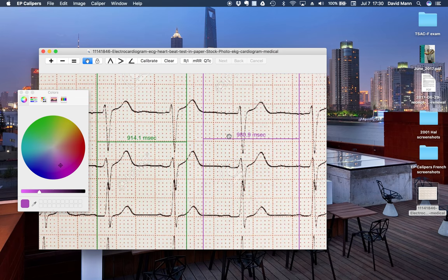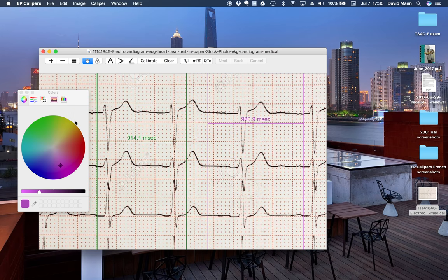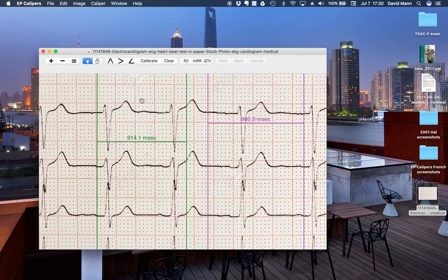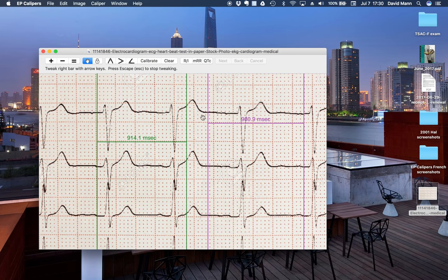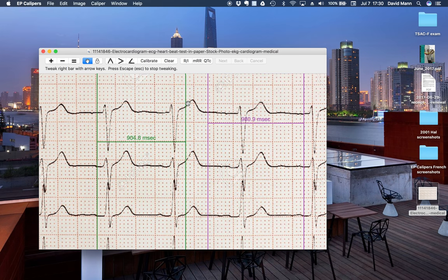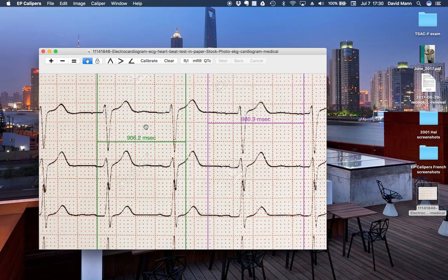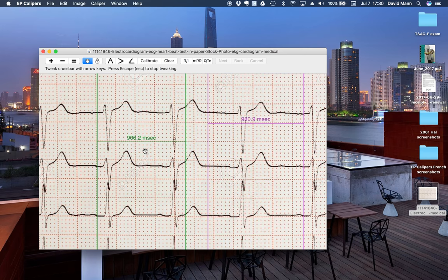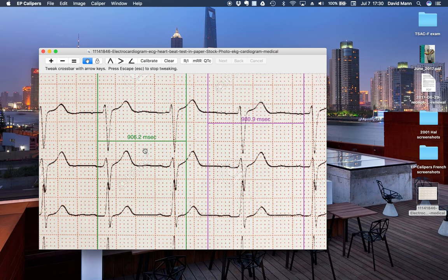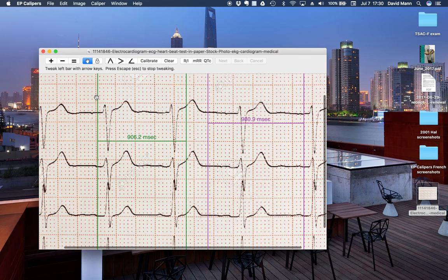So just some fun things you can do. You can also tweak the position with the keyboard, at least on the desktop version, the laptop versions. Using the arrow keys, you can make fine measurements, moving the whole caliper or just a component.